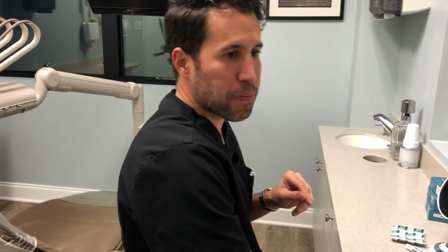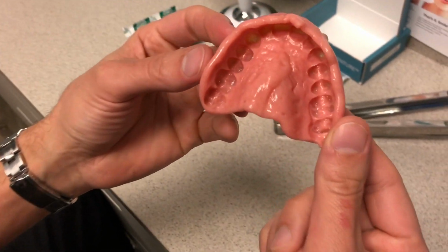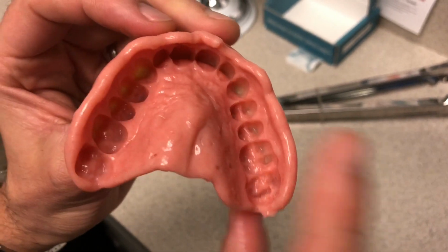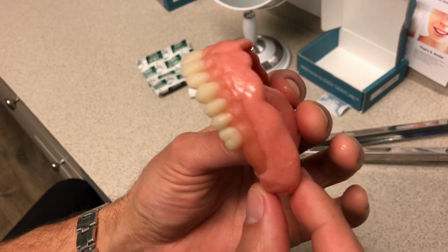Occlusion lined up. Obviously not aesthetic because it fits over my teeth. And, all right, so I adapted it. You can see how the Easy Denture fully adapted, capturing my entire palate, capturing my vestibule, capturing my soft tissue, all my flanges. Perfect occlusion, actually really good occlusion.